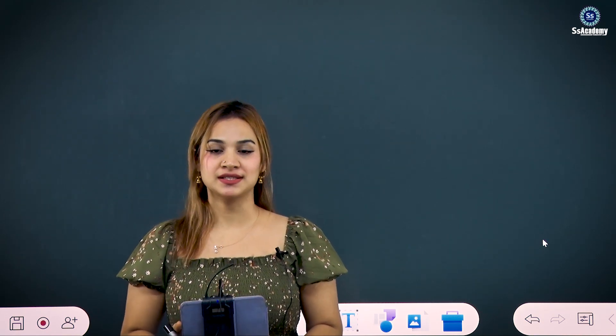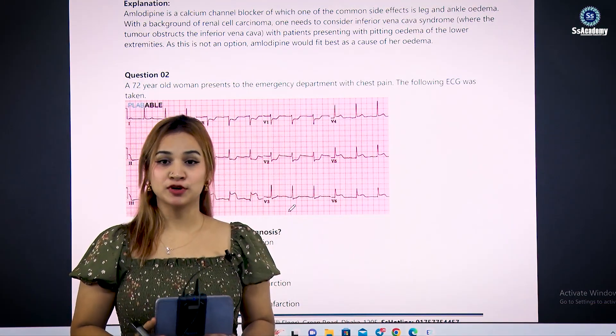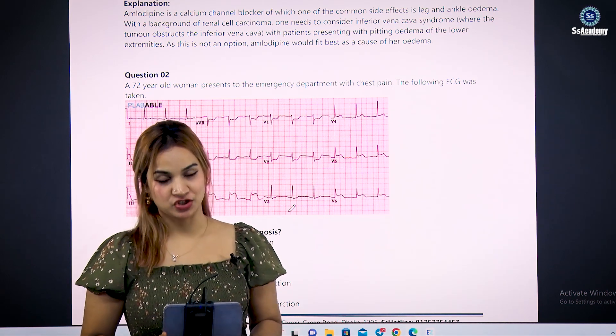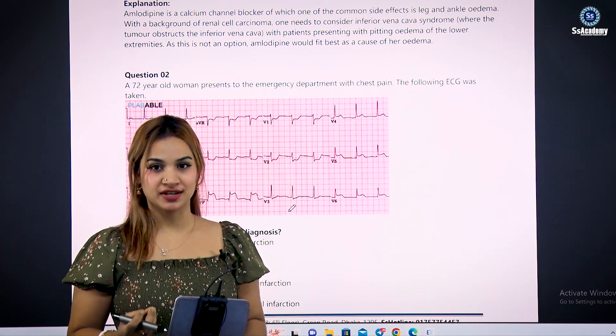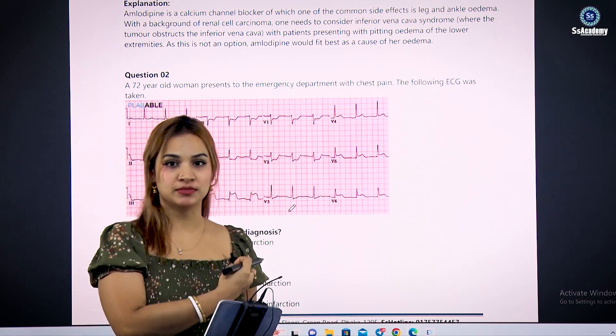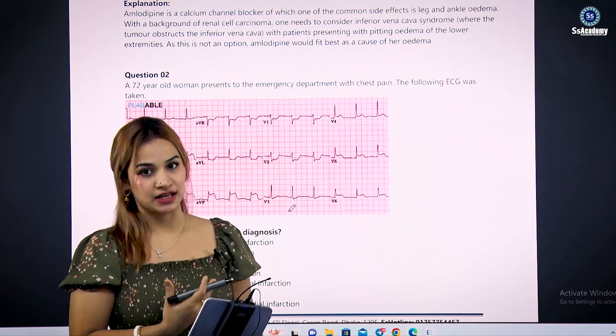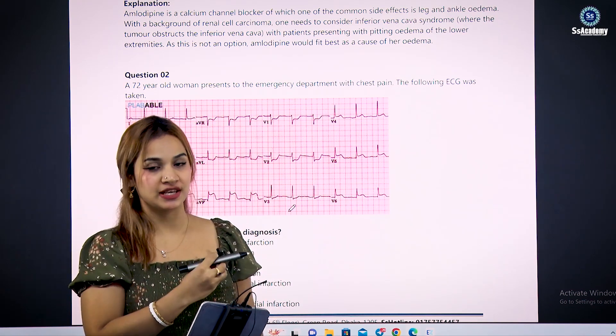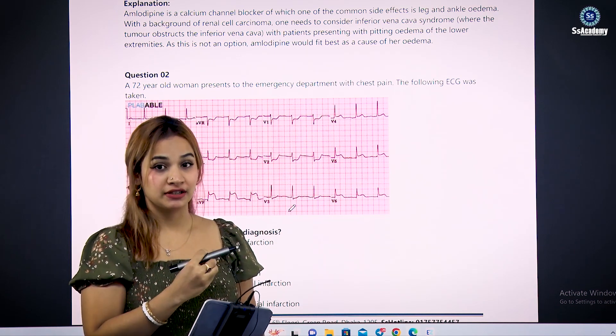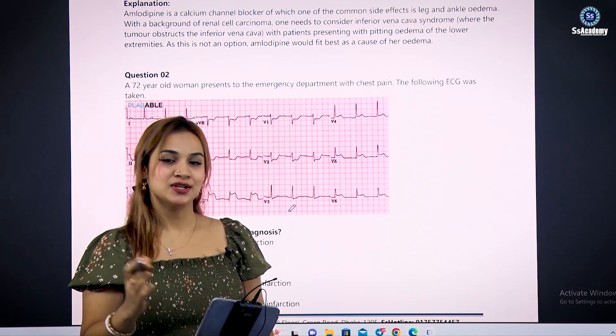Hello dear doctors, welcome to this cardiology practice session. In today's session we will learn how to approach ECG in our player exam, where we encounter two to three ECGs. We will practice from recalls of the last five years' questions, and I will give you tips and tricks on how to clinch the diagnosis directly from the ECG without needing the detailed question explanation. Let's start.